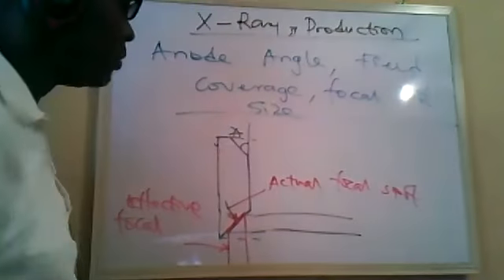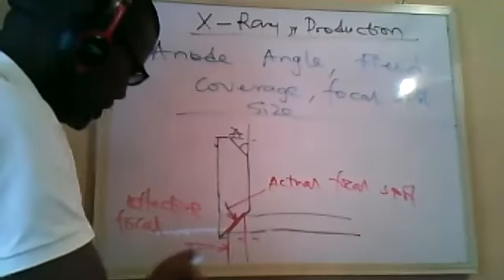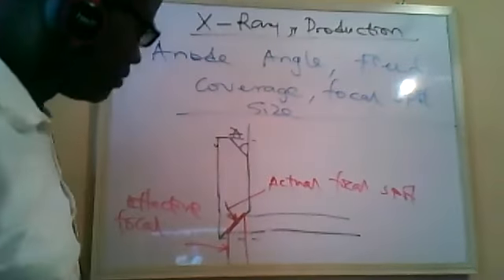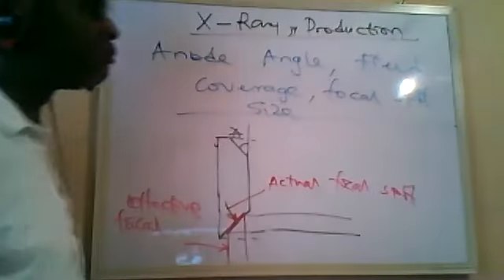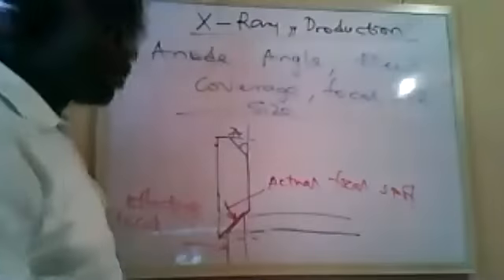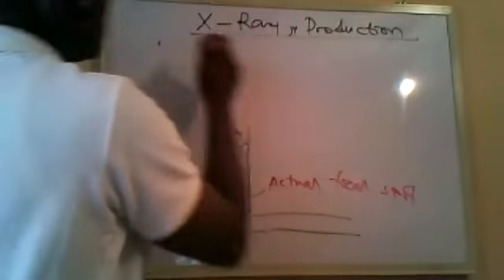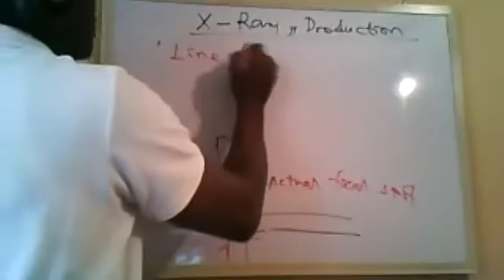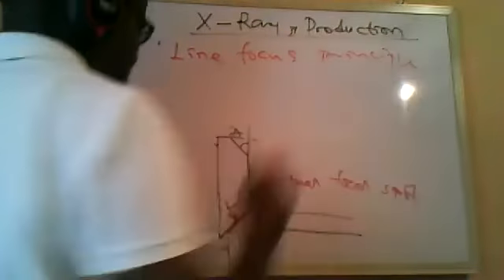How does change of this affect the effective focal spot? It brings us to the principle we call the line focus principle. So this is important: line focus principle.